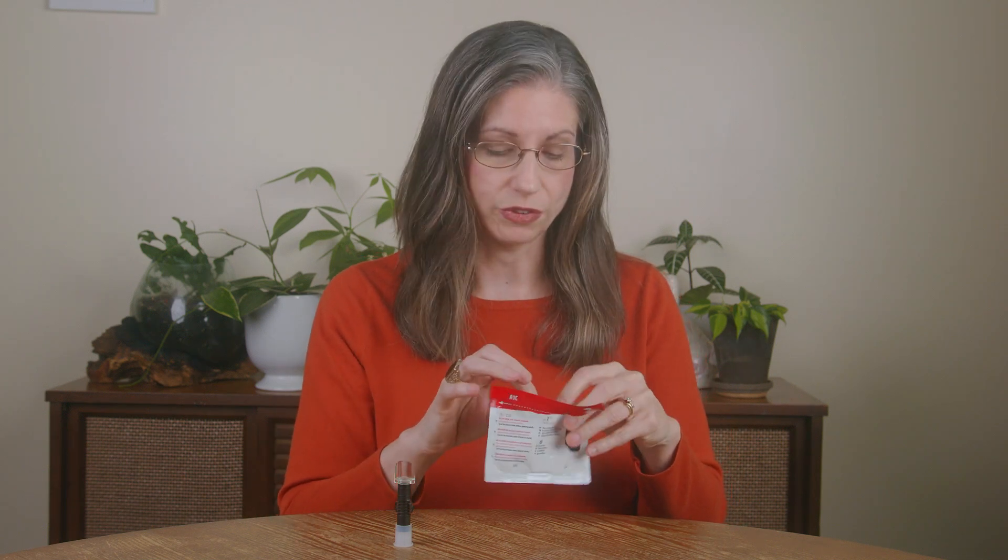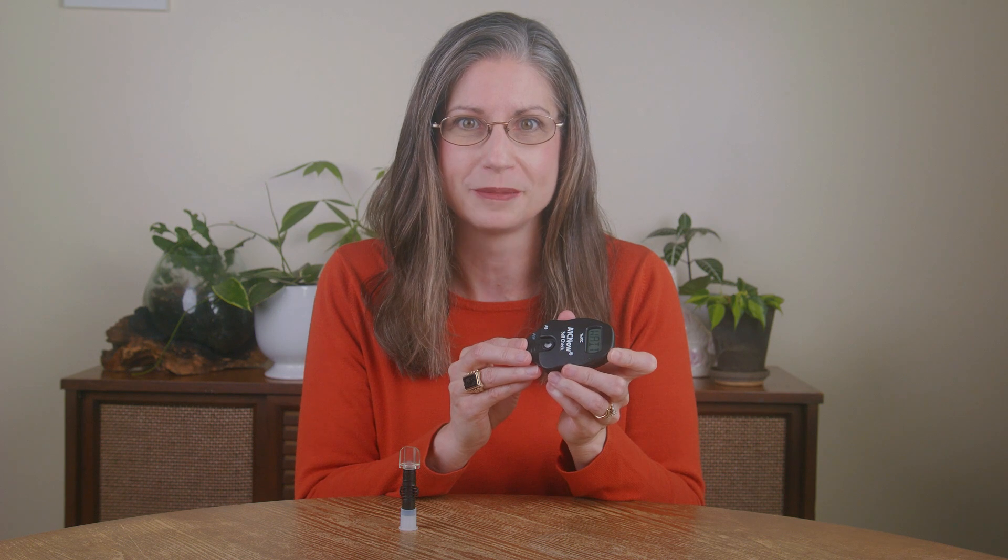Go ahead and find the pouch with the number two, which has the test cartridge, and open it. To make sure that the test cartridge matches the analyzer, I'm going to verify that the codes match. See how the analyzer says A9 and the test cartridge also says A9 — that means the codes match and you can proceed with testing. Now insert the cartridge into the analyzer with the white circle facing upwards. Press and insert the test cartridge until you hear the click confirming it is in place, then rest the analyzer back down on a flat surface.